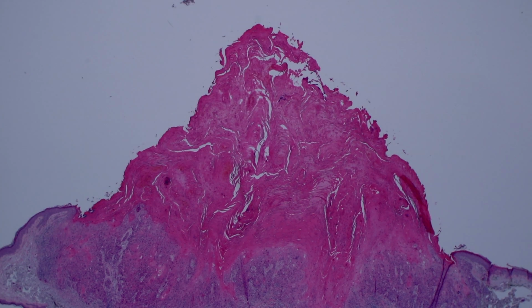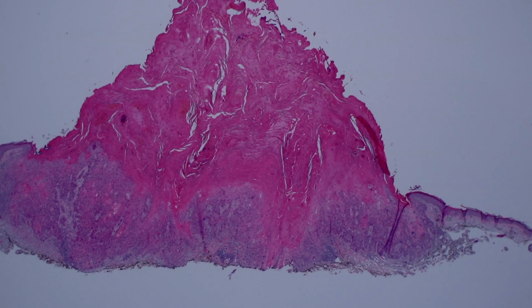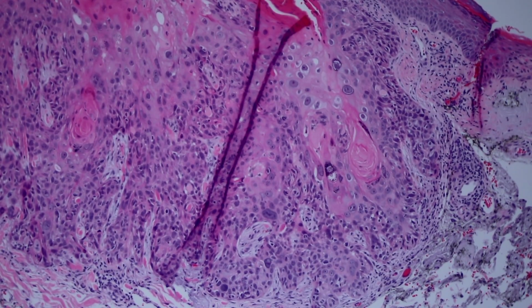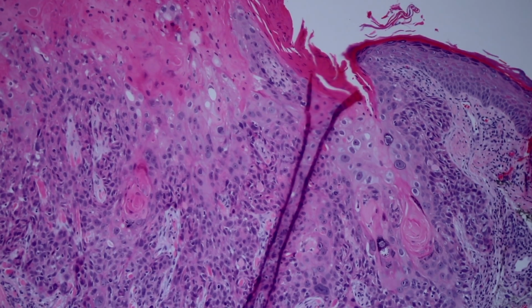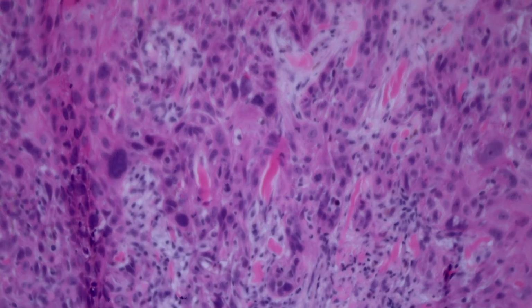That large thick layer of para over top looks like a horn clinically. Horns can have squame underneath them. They can have squame in situ or invasive squame, but they can also have AK and other lesions. So there's really no way to tell what's making the horn unless you see underneath it. And in this case, there's clearly invasive squamous cell carcinoma down beneath it. You can see the tumor cells pushing down into the dermis. In this case, they're quite dramatically atypical, with big, ugly, pleomorphic nuclei, and you can see mitotic activity as well.